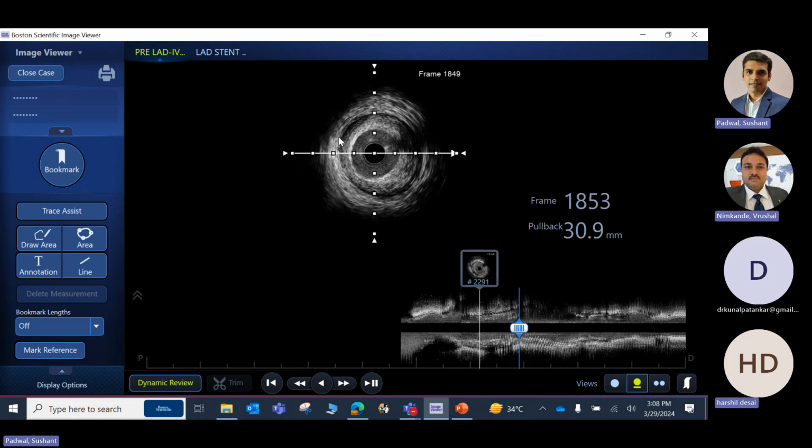That is the reason why the vessel is always measured from EEL to EEL. Am I clear? So the vessel is nothing but EEL to EEL, and the lumen is nothing but intima to intima. And between the intima and the IEL, the plaque deposition happens.